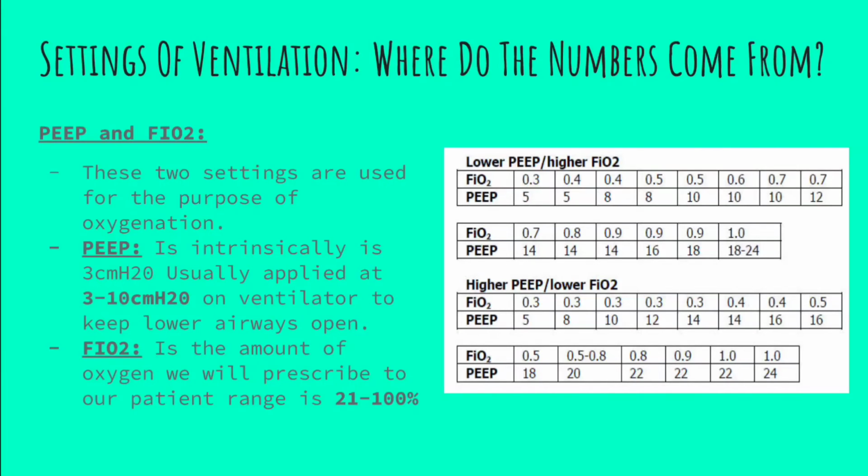If you have somebody that can tolerate PEEP well, we obviously know that adding PEEP can make a patient hypotensive by increasing intrathoracic pressure, which is going to reduce preload into the heart. This can be problematic in patients who are already hypotensive. But for those who can tolerate it, PEEP is going to be very, very effective.